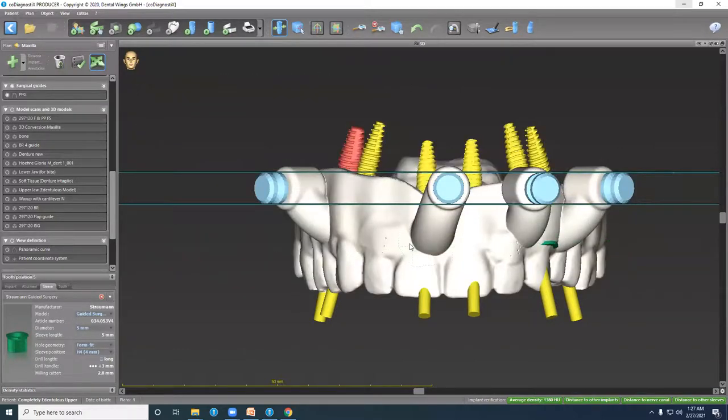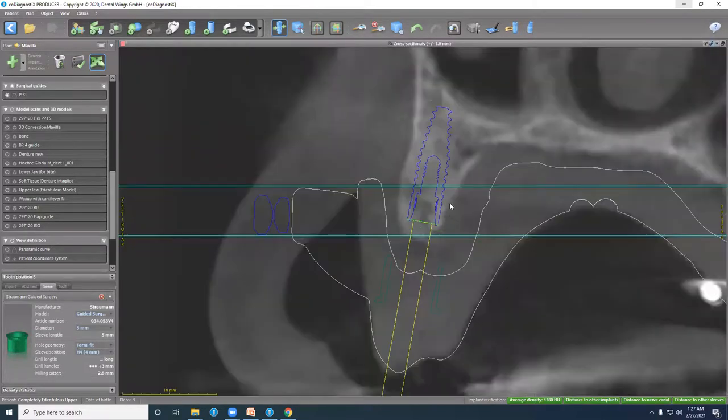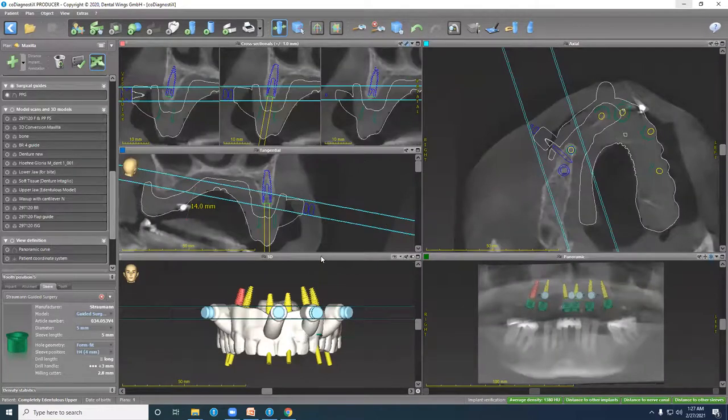As you notice here, this is a replica of the denture to be seating on the soft tissue. And this type of surgical guide will be used only for drilling the fixation osteotomies. This guide will be supported on the soft tissue, as we can see here, and it's an exact replica of the denture. After the fixation pin drilling is complete, this guide will be removed.